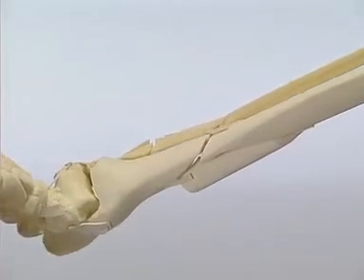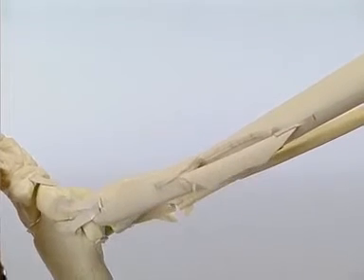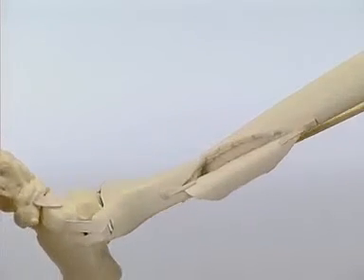The fracture is simulated on the plastic model. There are two large curved wedges on the tibia and a two-level fracture with small curved fragments on the fibula.